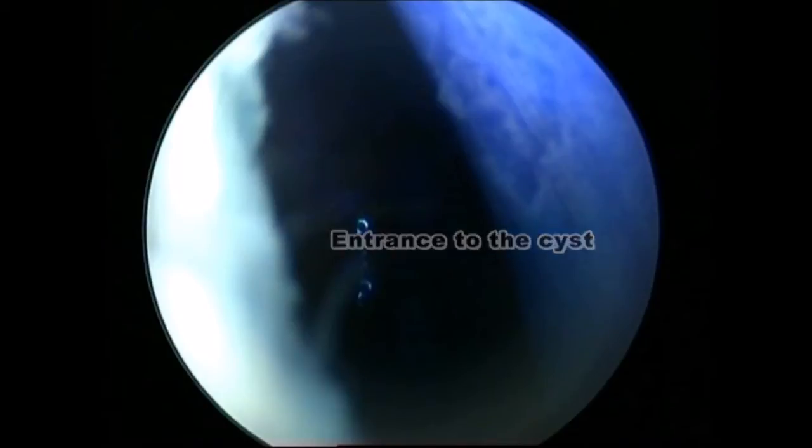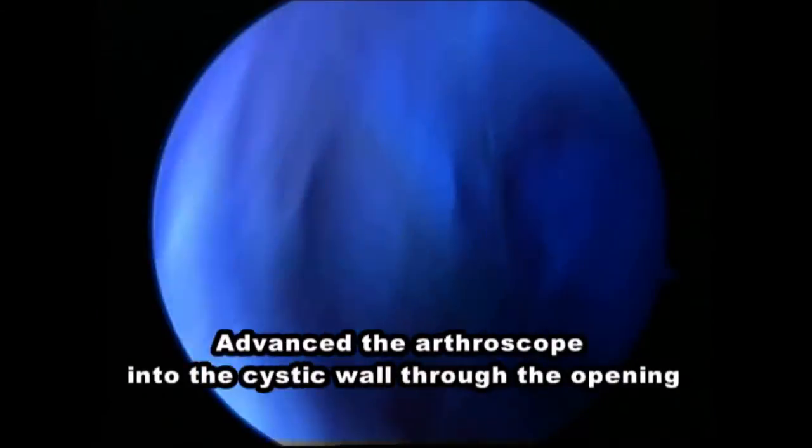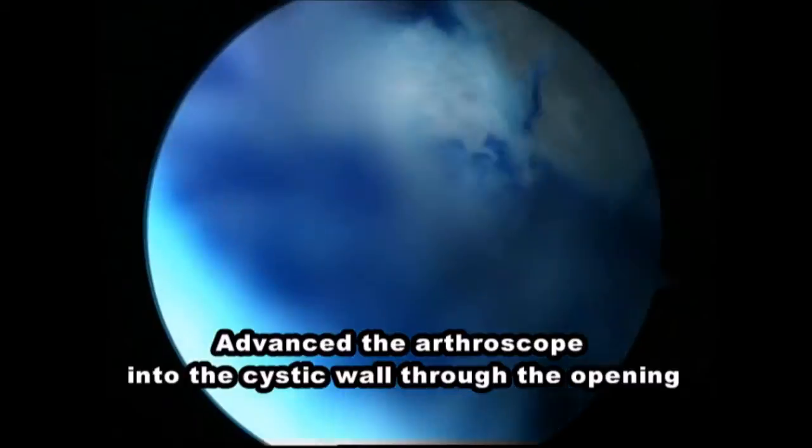After removing the fold, you will see the fluid in the cyst coming out. This is the entrance to the Baker's cyst. The arthroscope was then advanced into the cyst through the opening, which was posteromedial to the medial head of the gastrocnemius.